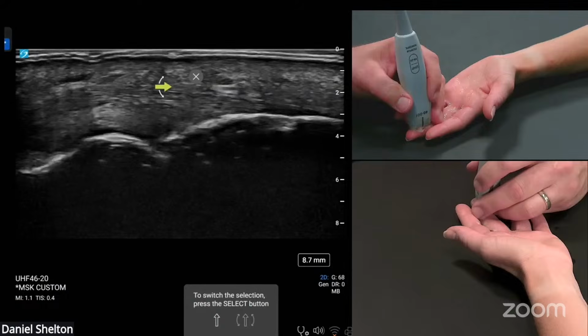And if you didn't catch our previous webinars on the hand, we did cover the dorsal hand, and then we went to the volar hand. And then we had a guest speaker, Dr. Dan Malone, rheumatologist, over 20 years, musculoskeletal ultrasound expert, who was our guest here in the studio to do the arthritic hand, where we covered MCPs, we covered some arthritic conditions that involve the base of the thumb. We talked a little bit about gout, injection techniques.